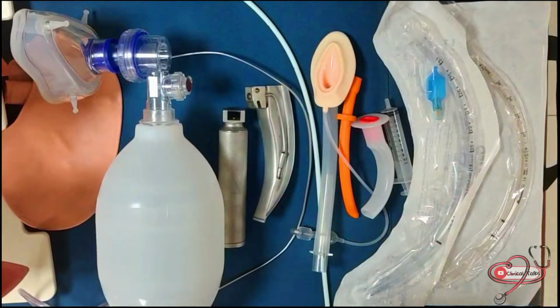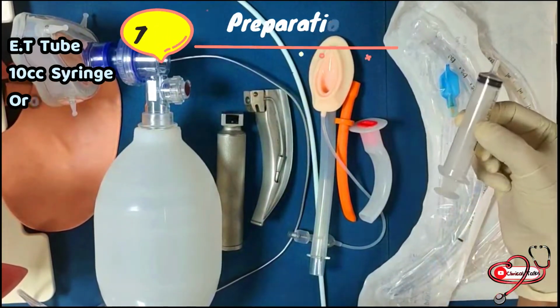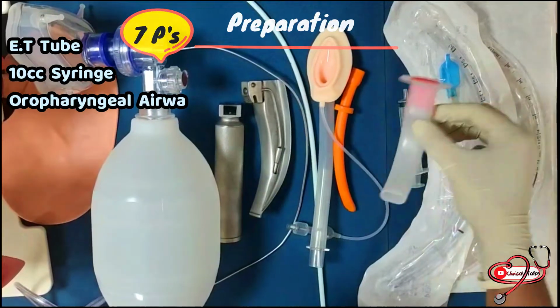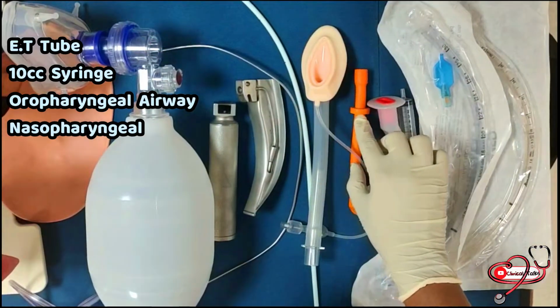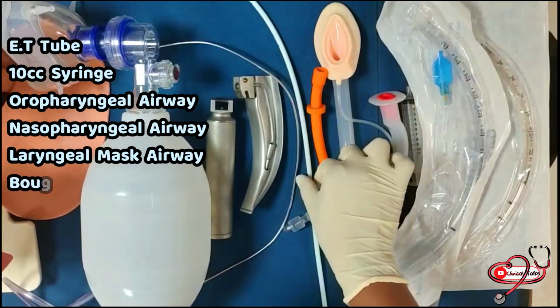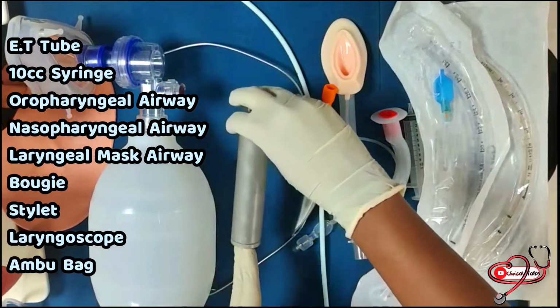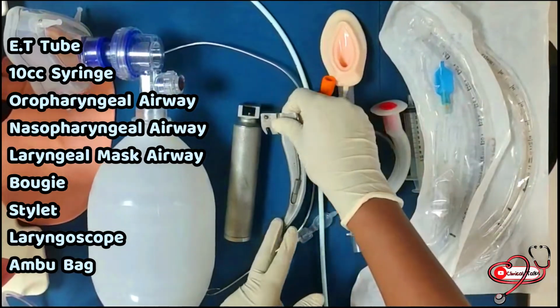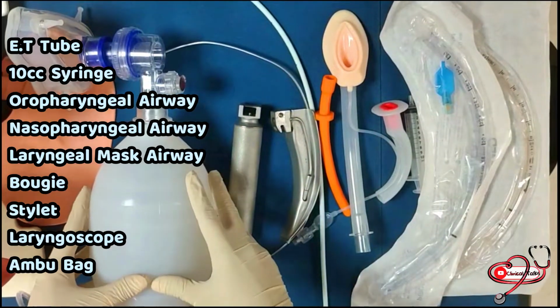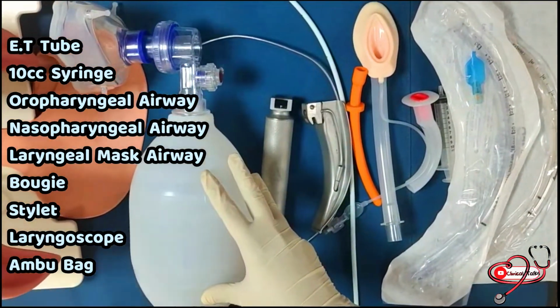Articles required for the intubation are endotracheal tubes of various sizes, a 10 ml syringe to inflate the endotracheal tube, oropharyngeal airway, nasopharyngeal airway, LMA (laryngeal mask airway), bougie, stylet, laryngoscope handle with blades of all sizes, bag for the bag mask ventilation, Ambu bag with mask and oxygen source attached.